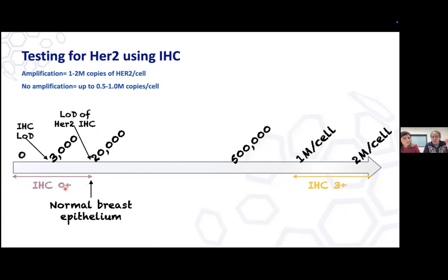Something that didn't stain was called zero, with terminology borrowed from conventional histopathology of calling things 1+, 2+, 3+ or 0. Those that stained a lot were called 3+. And then there were, let's say, 10% of cases where the expression wasn't as high as we should expect, but it was much, much higher than normal. So they were called 2+, and everything else that stained, but not as much as 2+, was called 1+. That was clear.